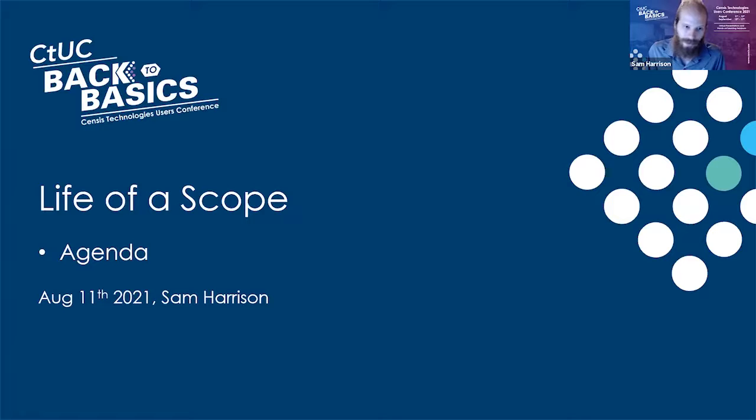We'll try to identify any areas where there might be gaps in the process, any areas where your staff may need review, or any areas where anything's broken. We'll identify these things and come up with a training plan, and then we'll send somebody out on site to work one-on-one with your staff to deliver that training.